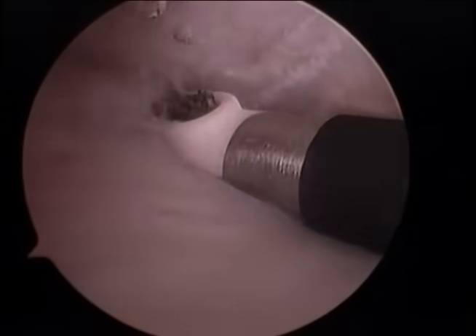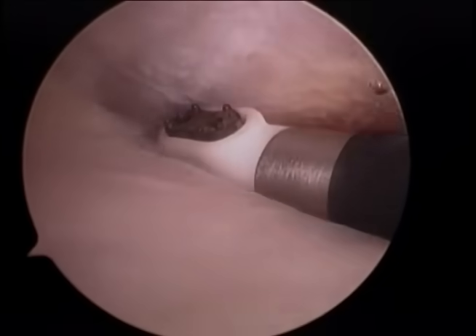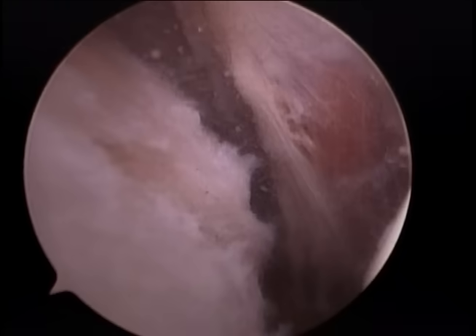We next bring our cautery device, which ablates soft tissue and is also capable of stopping any bleeding from the bursa. Our shaver is then used again in the lateral gutter of the subacromial space. We must clear out this bursal tissue, which is covering the bursal side of our rotator cuff tear. To the right of our shaver, the pink tissue is our deltoid. When our bursectomy is complete, we see our small rotator cuff tear.